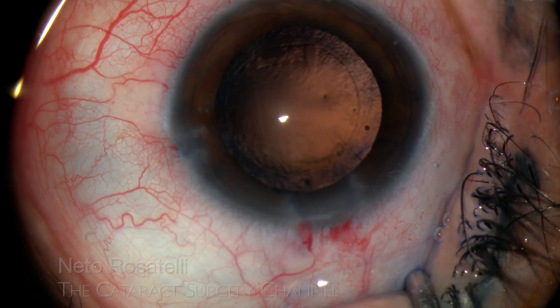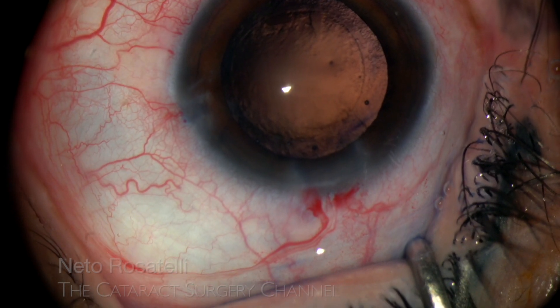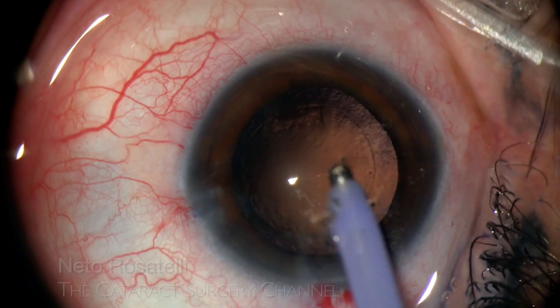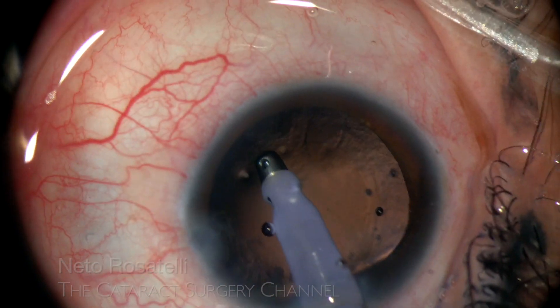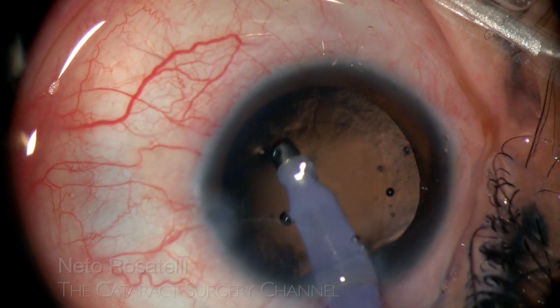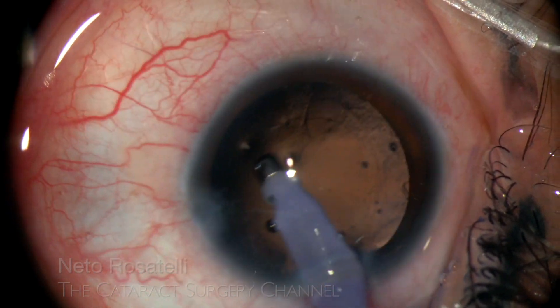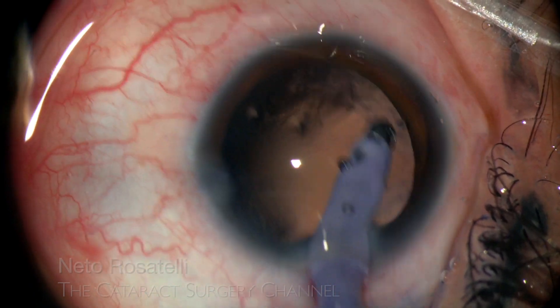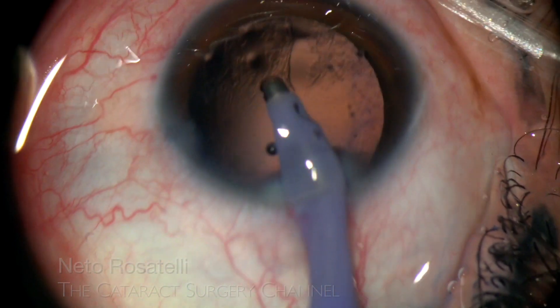This type of cataract often presents some difficult to remove adherent cortex. Here I go with the coaxial IA, to be able to aspirate the cortex and epithelial cells under the capsulorhexis edge. Luckily, there is no significant capsule fibrosis, an often encountered issue in cases like this one. Surely a good cortical and capsule cleanup will be possible.